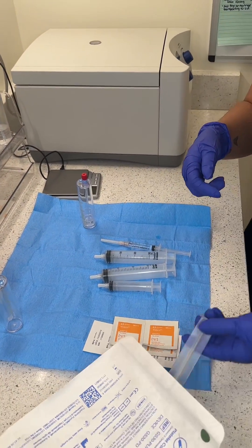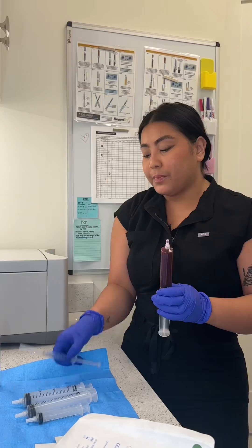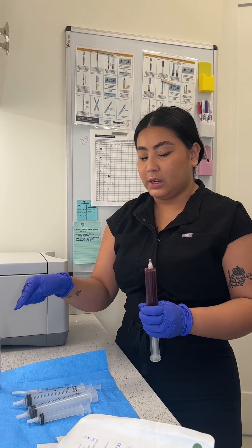Okay, so before you draw up, there's an anticoagulant that looks like this — 3 cc's into this little syringe, because that's what you're going to flush in here.